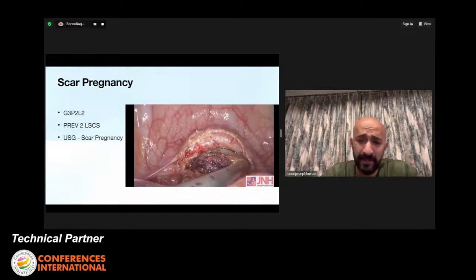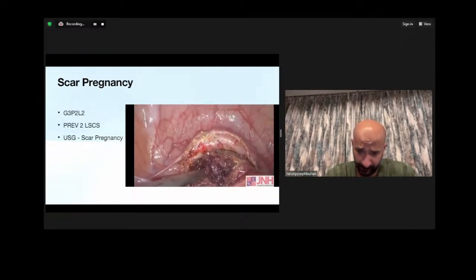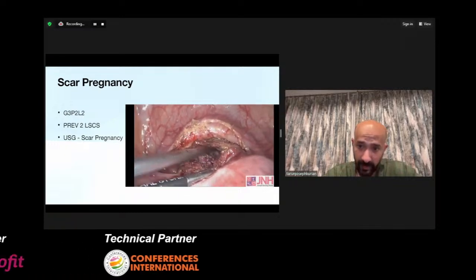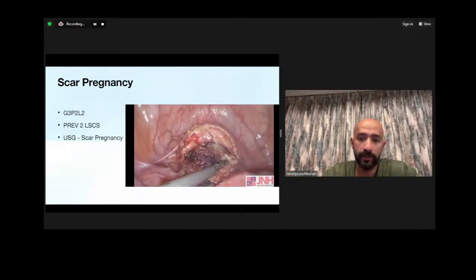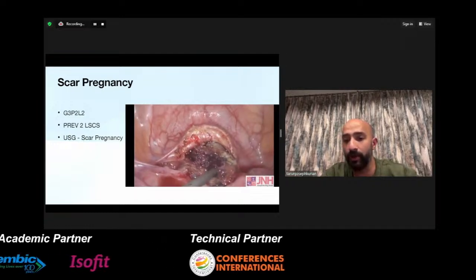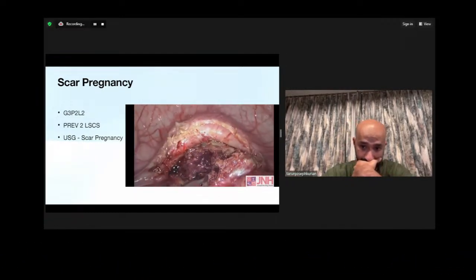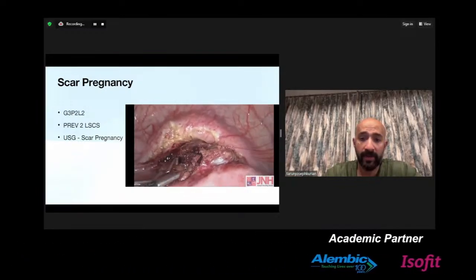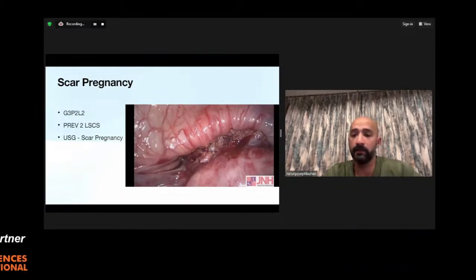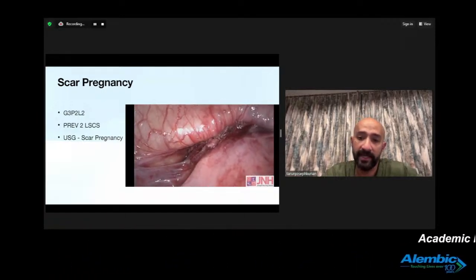It was a very friable tissue, and since we had already tackled a little bit of it from below, it wasn't coming out too easily from above. We tried our best, but we couldn't get too much of it above. So whatever was remaining, we went down below and using a cannula, we suctioned out whatever was remaining, what we couldn't get out laparoscopically. Once the entire thing was removed, we finished the removal vaginally at this portion.